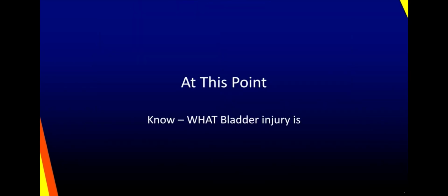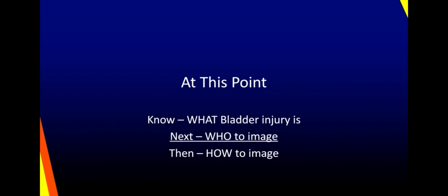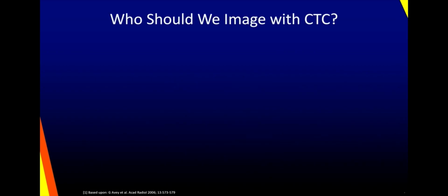Now at this point, we know what a bladder injury is. Next, we'll talk about who to image, and then we'll talk about how to image. So who should we image with CT cystography?